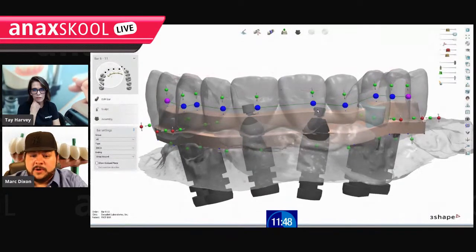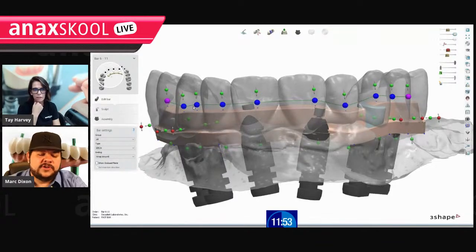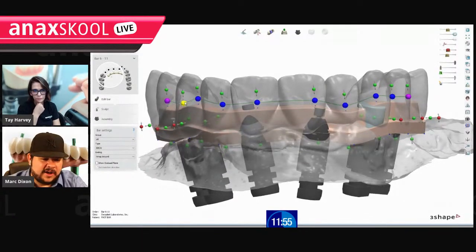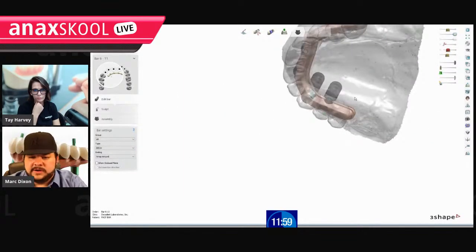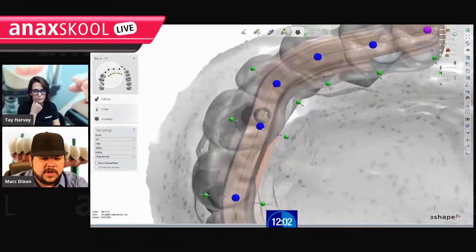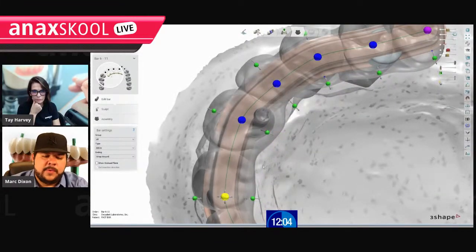And I was like, well, I'm not doing that over a bar. I'm not milling a zirconia frame over a bar. I'm sorry, a zirconia superstructure over a bar that just got all distorted. So I was like, yeah, I'm not even going to bother. But I can tell you the denture module, I don't really know it. But I know that people do it that way. I just went and tried.